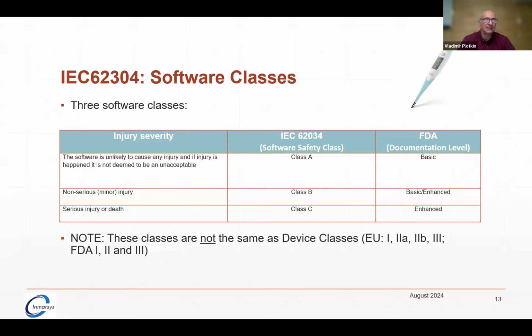If you have any concerns, please refer to a medical professional. So then it can be class A, because you've been warned it's not a diagnostic tool.